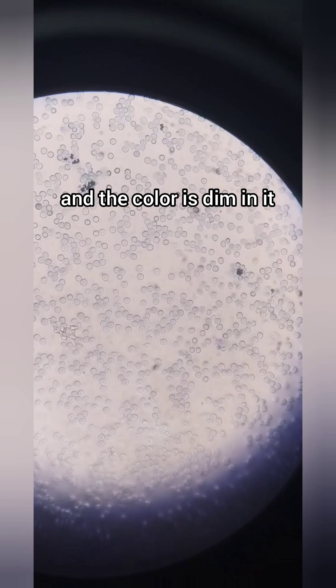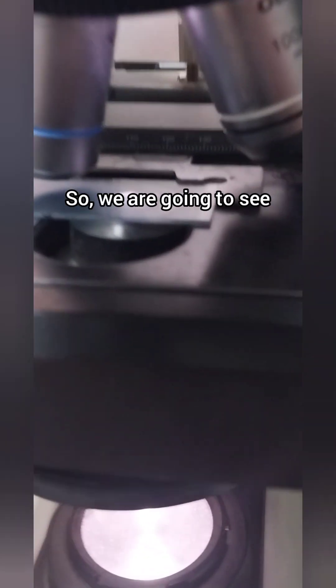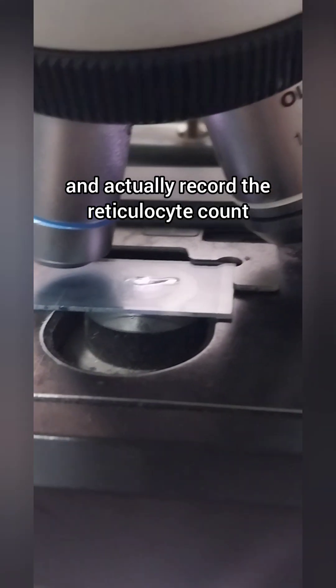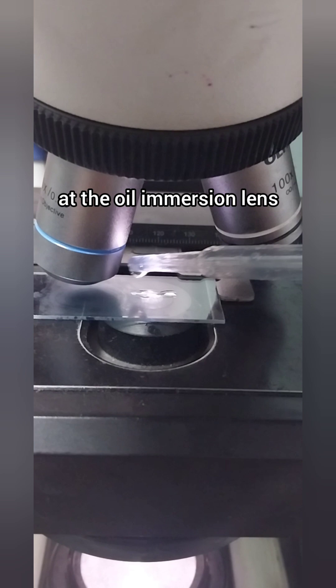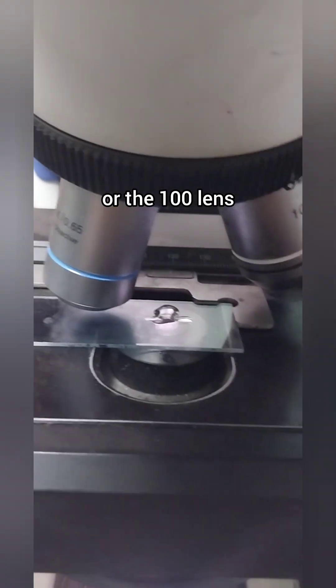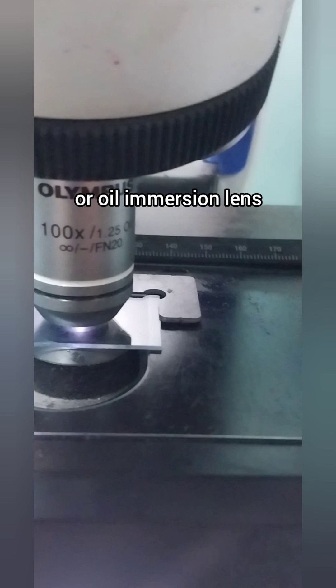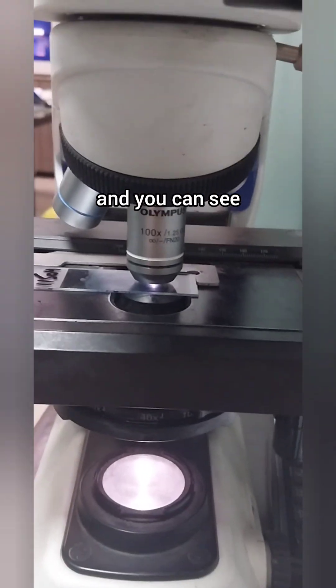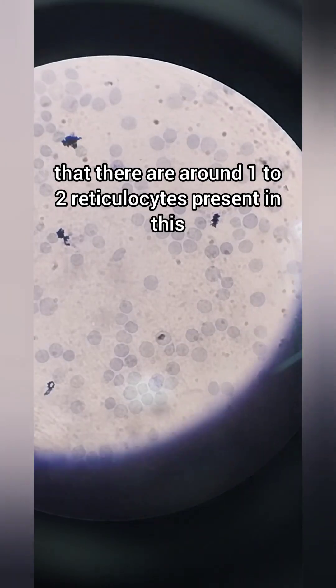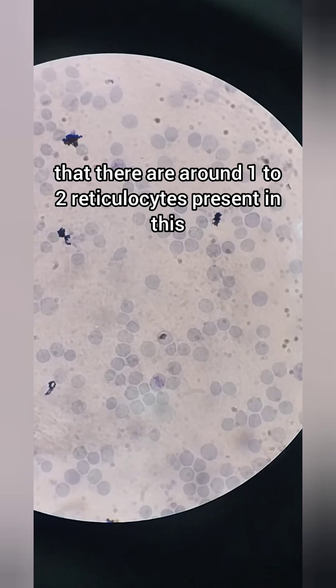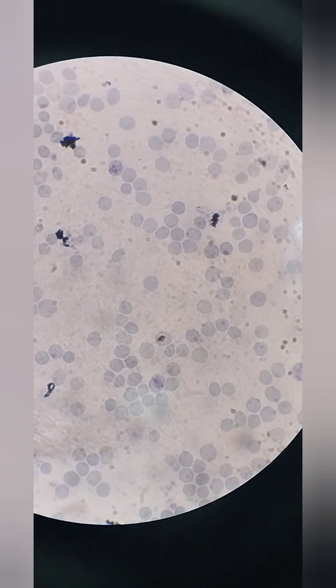We are going to see and actually record the reticulocyte count at the oil immersion lens or the 100x lens. Here we are focusing at 100x or oil immersion lens, and you can see that there are around one to two reticulocytes present in this one field of RBCs.